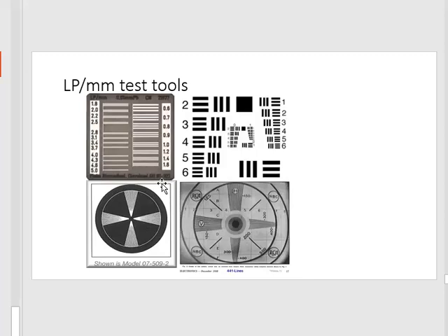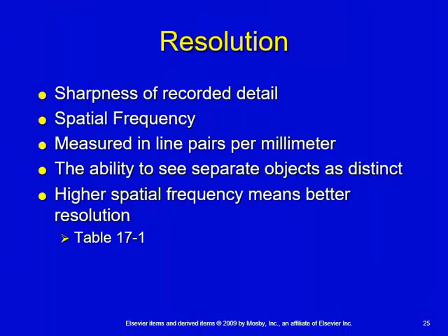So the resolving power of your computer, and also of your image receptor, and even of your X-ray tube, is going to be determined by where these things blur. So just on this size, I can see the difference between those lines there, but below that, to my eyes, they start to blur. You can't really differentiate them. So there's just different line pair per millimeter test tools. And traditionally, the STAR test pattern has been long considered to be the best for radiography.